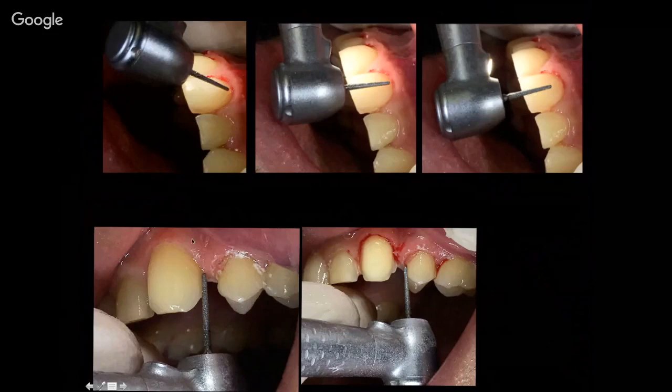What if we have gaps or spaces between the teeth? It's recommended to keep our margin as much as possible on the palatal walls to close the gap from the palatal to the buccal part and cover all the crestal part. This way the patient will not feel a concavity or a void on the palatal side.